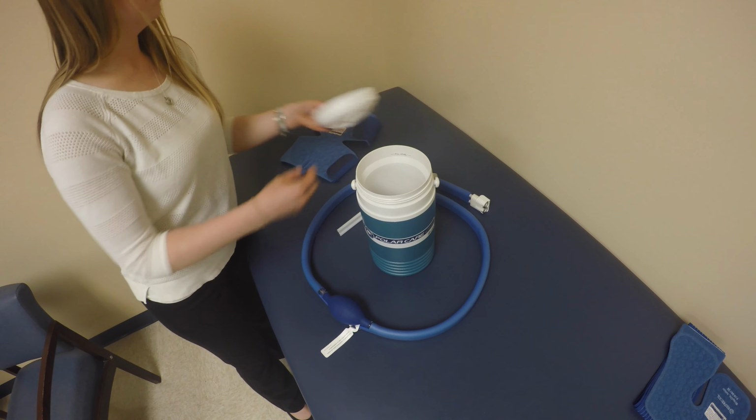Today we're going to show you how to use this unit with the wrap-on knee attachment. However, the Polar Care Cub does come with other wrap-on attachments that you can use for various injuries. In order to place the attachment onto the hose, you'll hold down the silver pieces and press in till you hear it click. These should then be raised. That's how you know it's attached.